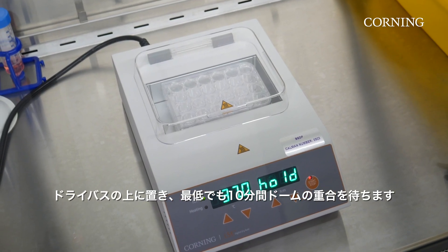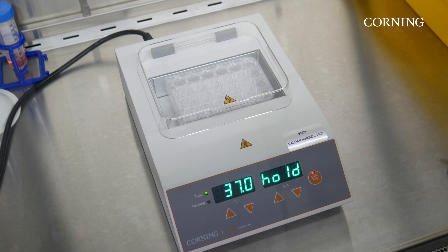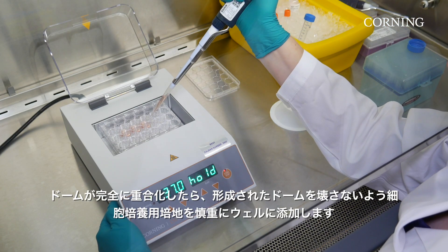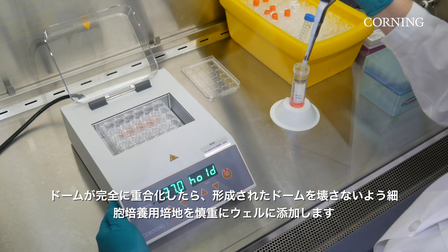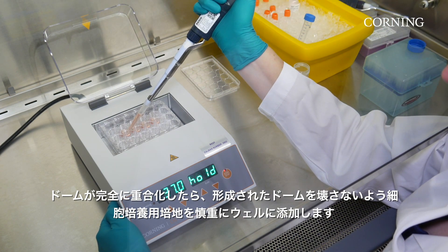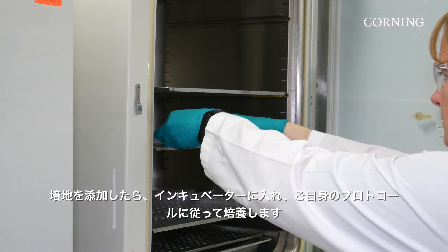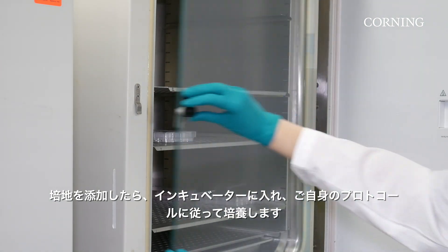Let the plate sit on the dry bath for at least 10 minutes until the domes have polymerized. After domes are fully polymerized, a growth cell culture medium should be carefully added to the wells so as not to disturb the Matrigel Matrix dome. Once medium has been added, place the plate into the incubator and culture your organoids according to your protocol.